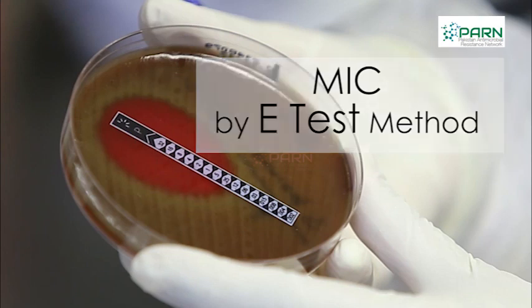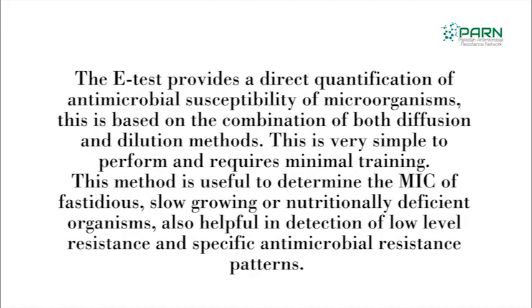MIC by E-test method. The E-test provides a direct quantification of antimicrobial susceptibility of microorganisms. This is based on the combination of both diffusion and dilution methods. This is very simple to perform and requires minimal training. This method is useful to determine the MIC of fastidious, slow growing, or nutritionally deficient microorganisms. It is also helpful in detection of low-level resistance and specific antimicrobial resistant patterns.